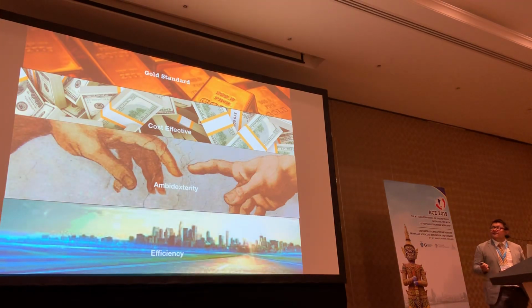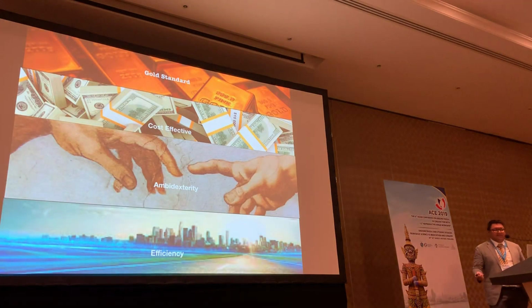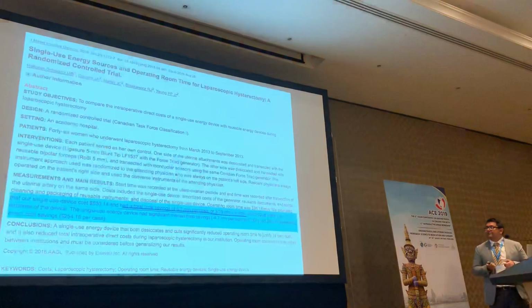So as I said, all advanced energy that comes out is going to compare itself to the bipolar, which is the gold standard. It's the most cost effective because it's reusable, unless you don't know how to use your energy and you keep damaging your forceps, then it becomes expensive. It teaches you to use both your hands and efficiency. So beware of industrial propaganda, okay? So there is a use for advanced energy, but for basic surgeries, you do not bring a gun to a boxing match, you use your fists, both of them, okay?